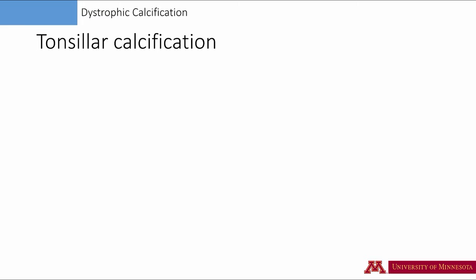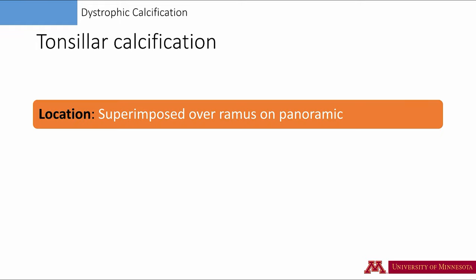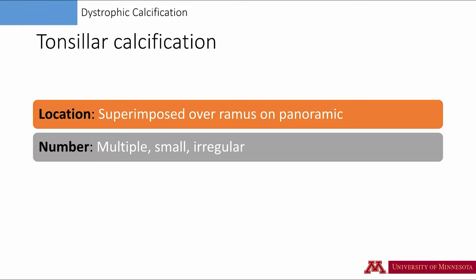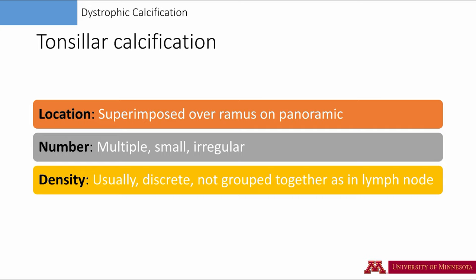Let's review tonsillar calcifications. Again, the location is critical for diagnosis. The tonsillar calcifications can be superimposed over the ramus on a panoramic radiograph. Some of these calcifications are located distal of the ramus. On the CBCT scan, we'll see the calcifications on the lingual aspect of the ramus. Lymph node calcifications were near the angle of the mandible, while tonsillar calcifications are superimposed over the ramus of the mandible. Similar to a lymph node calcification, the tonsillar calcifications are also multiple, but these are irregular in size and discrete. Unlike lymph node calcifications, tonsillar calcifications are not grouped together.